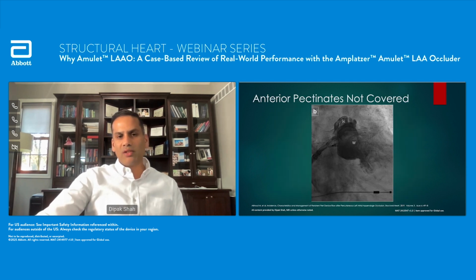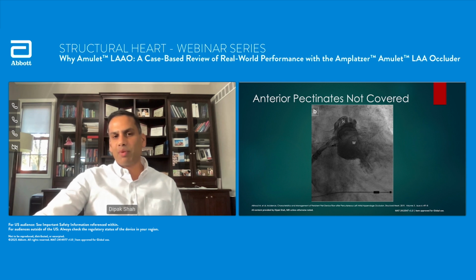This is what I alluded to before, these anterior pectinates. Again, this area here is where Watchman really struggles, because what are you going to do with this, right? This is the proximal area where Watchman has a difficulty covering this, right? So if you go any more distal, again, you're going to leave this significantly behind.